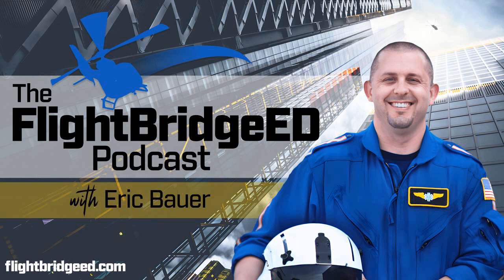Number 2, tidal volume. Tidal volume is going to be the biggest thing that's going to raise your plateau pressure. And again, I talk about this in the podcast on driving pressure. We always want to start our tidal volumes, and we talked about this in part 1, at 6 mils per kilo, since all the evidence is showing that 6 mils per kilo decreases our morbidity and mortality.